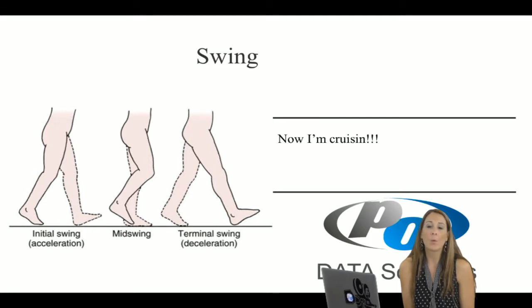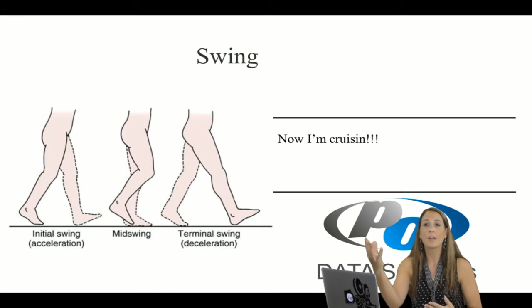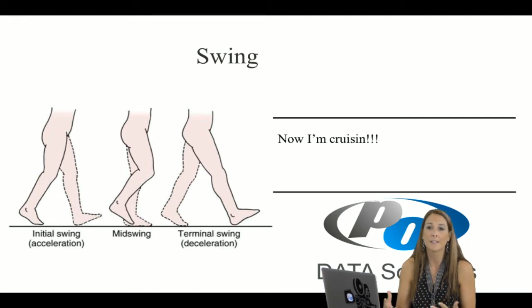And that's when swing phase comes into play, because you're just cruising along and you're able to get comfortable enough to show and use these tools with your patients and bring the iPad over to them and show them what you're seeing, or have a video camera in your office and put a big screen TV up so that you can show them what I'm showing you here on the screen so that they can see themselves and how they're walking and how they're progressing. And that's really the next step, and that's when you're cruising.